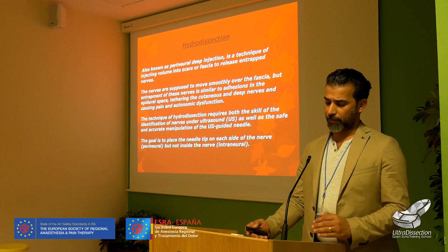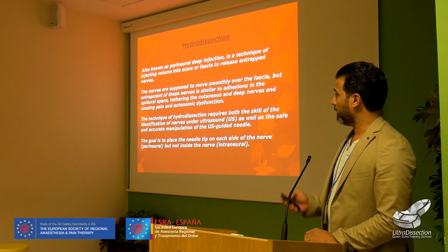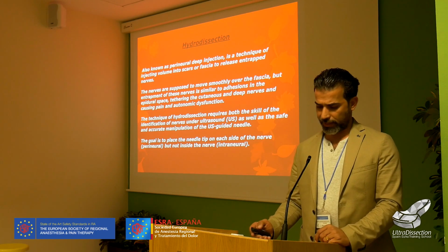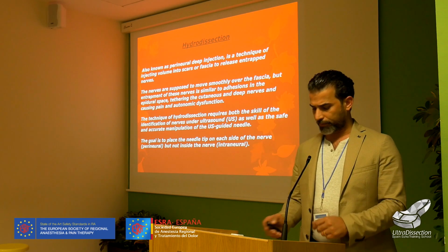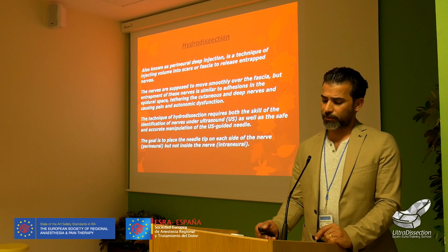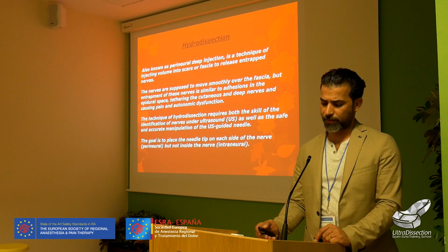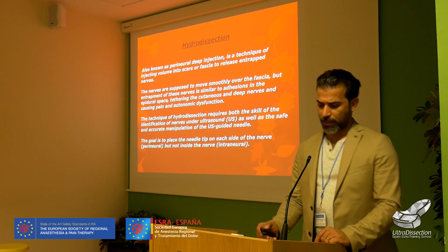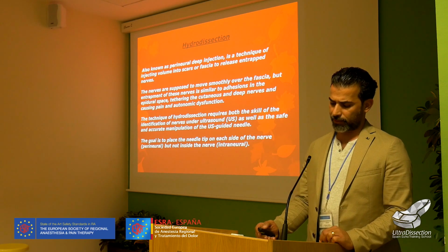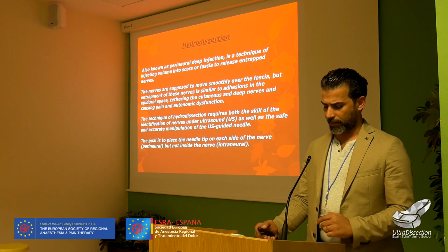So this is the main topic, the main project for nerve release: to use the hydrodissection technique under ultrasound for nerve releasing. The nerves are supposed to move smoothly over the fascia, but entrapment of these nerves is similar to adhesions in the epidural space, tethering the cutaneous and deep nerves and causing pain and autonomic dysfunction. The technique of hydrodissection requires both the skill of identifying the nerves on ultrasound, as well as safe and accurate manipulation of the needle under ultrasound.